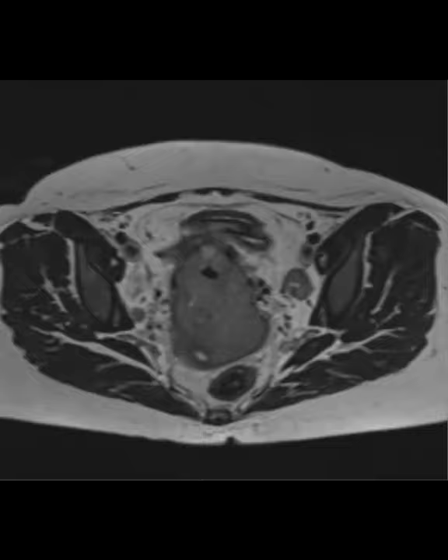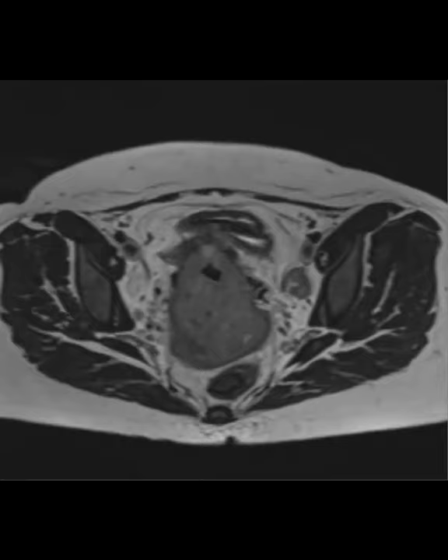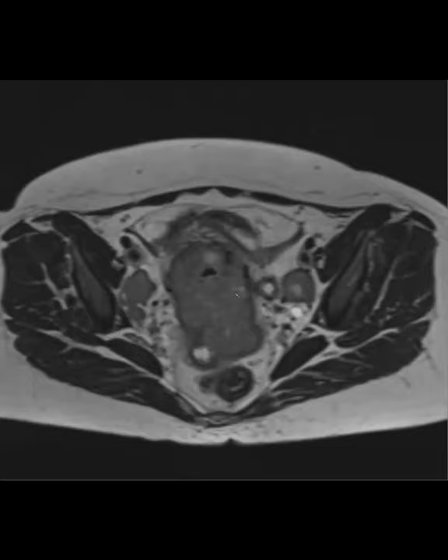I think it's cervical, or is it endocervical? No, it looks cervical, a bit centered in the cervix, I think. Yes, exactly. And then mets everywhere. I mean, lymph node metastasis and local extension. Exactly. So this is a large kind of fungating cervical mass, cervical cancer.